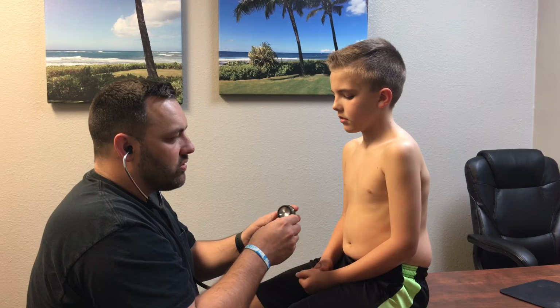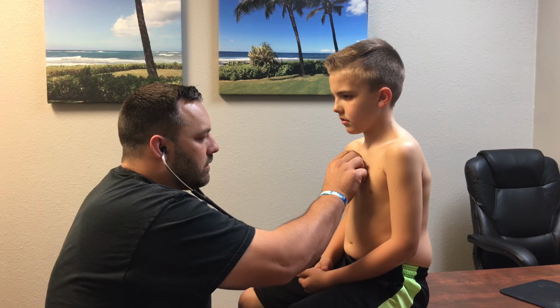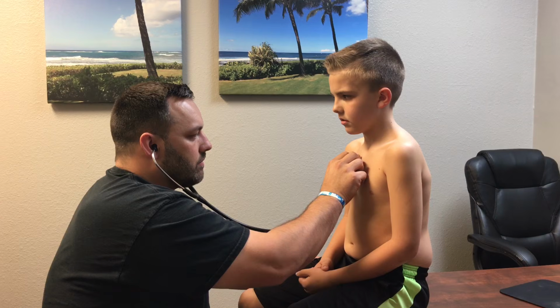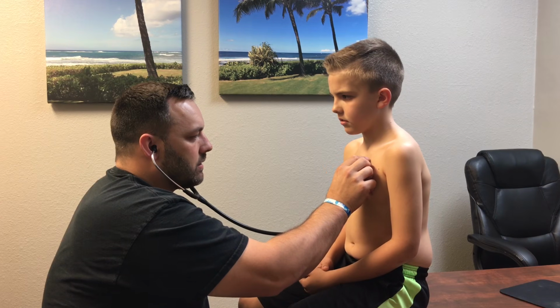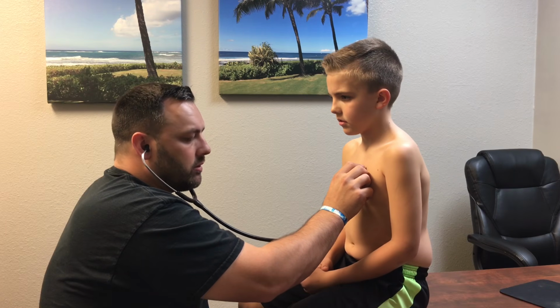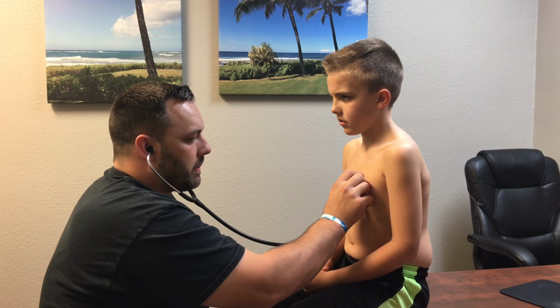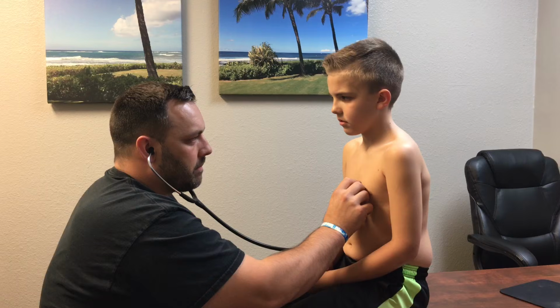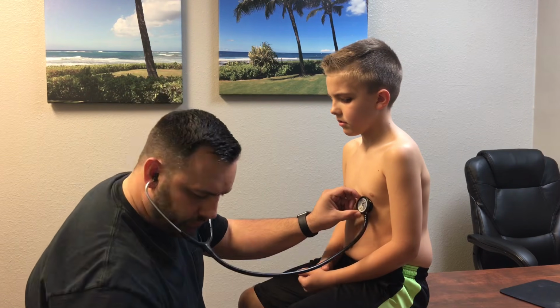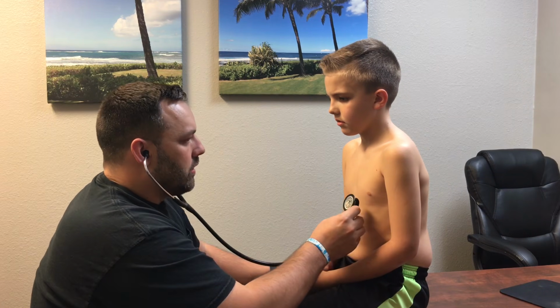So one of the things that we can also do is not only listen with our diaphragm, but listen with our bell. So I'm going to do that as well. This is typically for lower pitch sounds, and it's good for hearing any heart murmurs, any abnormal beats of the heart. Okay, so he's good there.